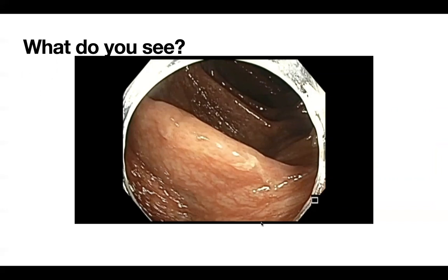And you will see in this video that I actually slipped back. And I didn't include a lot of that video of slipping back and trying to maintain the stable position. I did struggle to maintain a stable position.